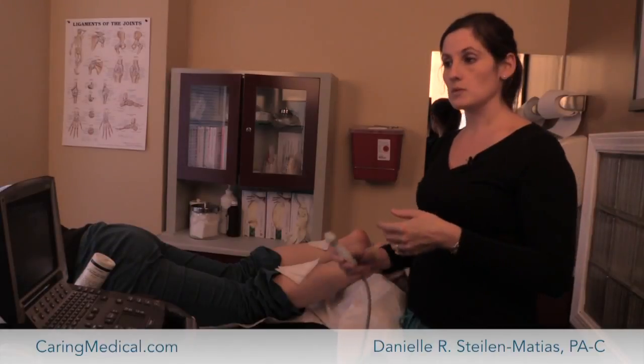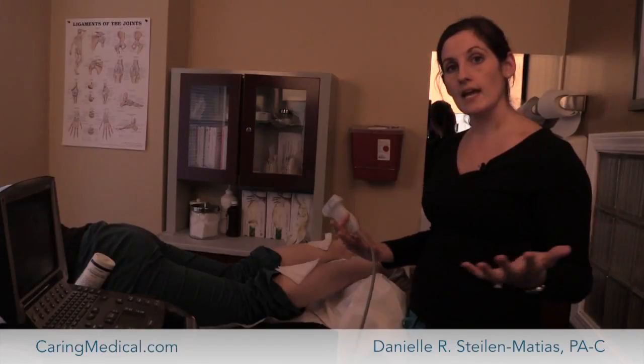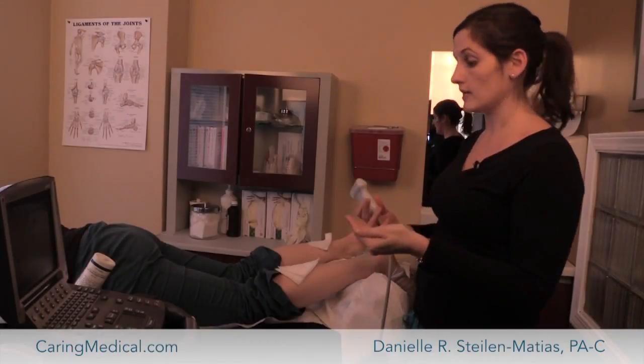we can actually use the ultrasound machine to help us: one, find out do they have a tear, is it really degenerated, and two, even help us to guide injections into specific areas of injury.